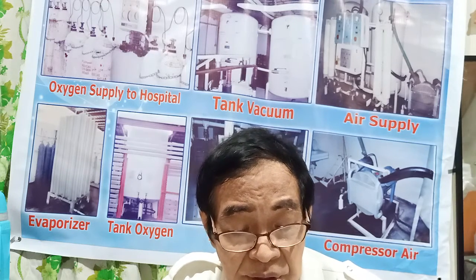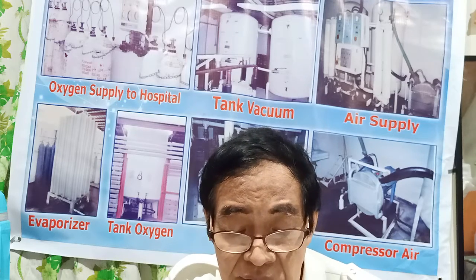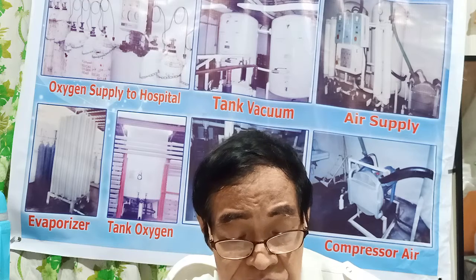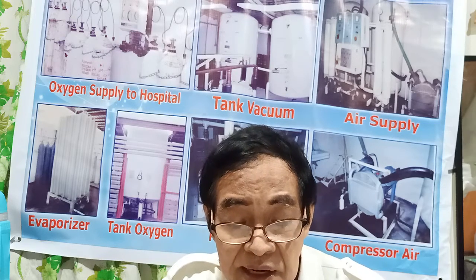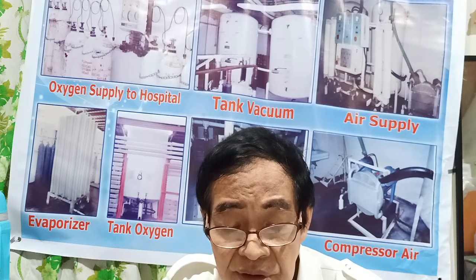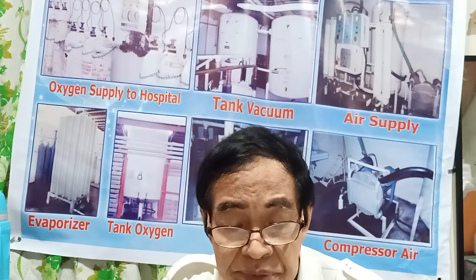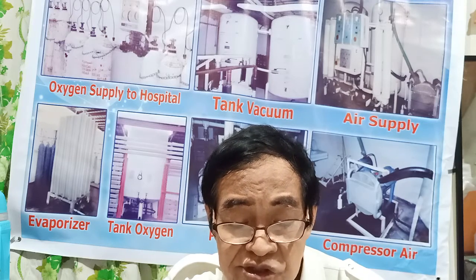And also, important is the use of the correct materials for a cryogenic installation. Certain grades of pipe become brittle, and materials suitable for cryogenic temperature must be used in such installations.